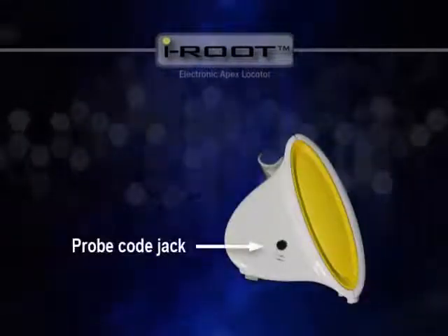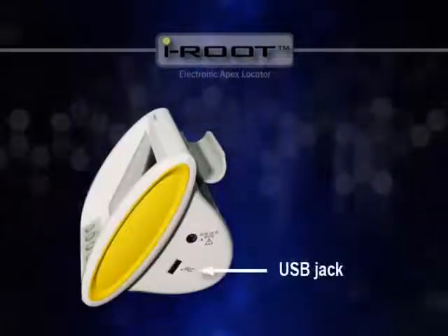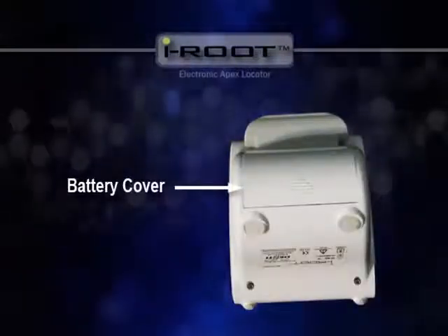On both sides are the probe cord jack, the USB port for software option, and the power adapter jack for charging. The battery cover is located on the back of iRoot.